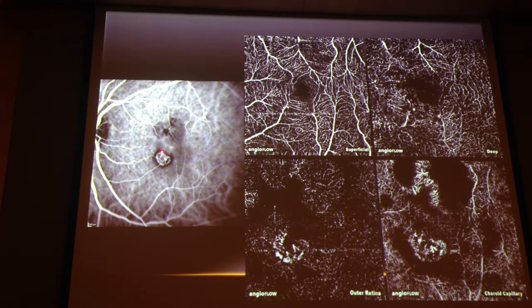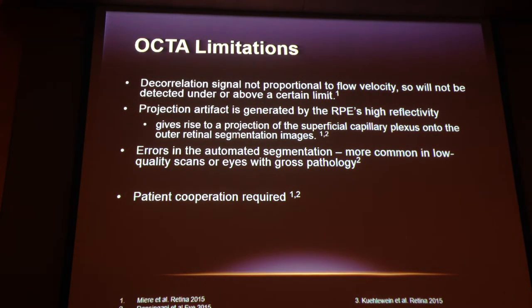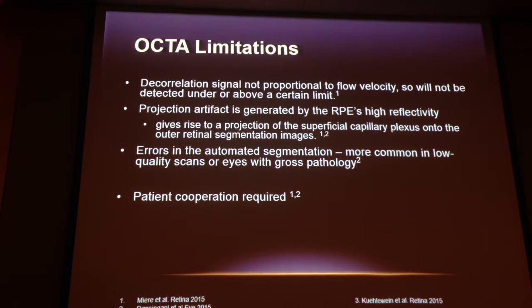One of our patients shows a nice RAP lesion on the ICG angiogram. On the OCT angiogram superficial layers: nothing. Deep plexus: a hint. Then a nice tuft in the outer retina as well as the choriocapillaris. Limitations for OCTA in RAP are the same as those that apply to all OCT angiograms: patient cooperation is needed, artifacts are possible, and segmentation errors occur whenever there's anatomical distortion. Flow velocity is something we all have to be conscious of — if it's outside the detectable range, we may miss the lesion. We need to share our experiences as technology advances.